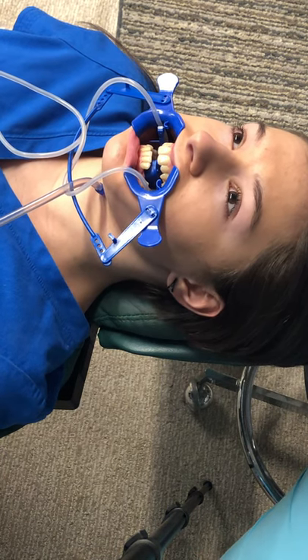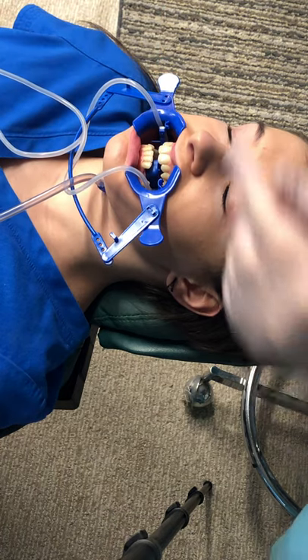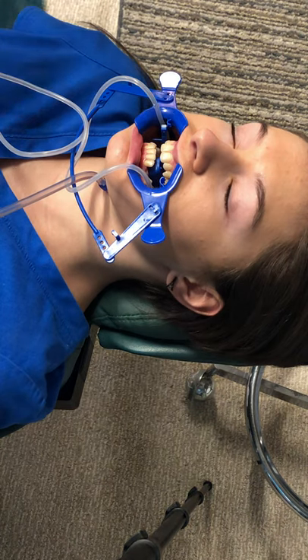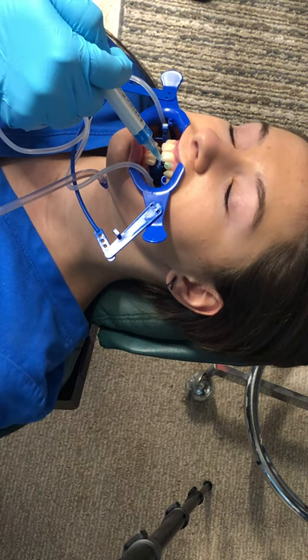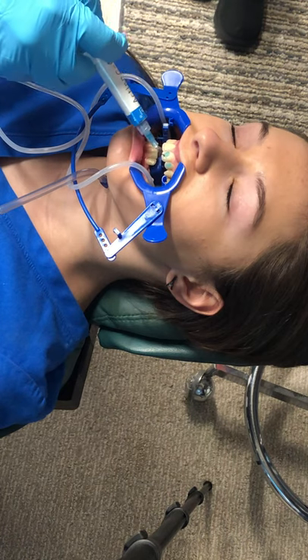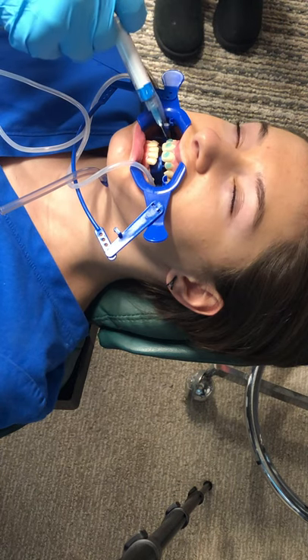You want to make sure the teeth are clean and now dry. We're going to take your gel etch and we're just going to do the front four teeth — put it right where the bracket's going to go. No need to cover the entire tooth. So we're going to do upper two to two.